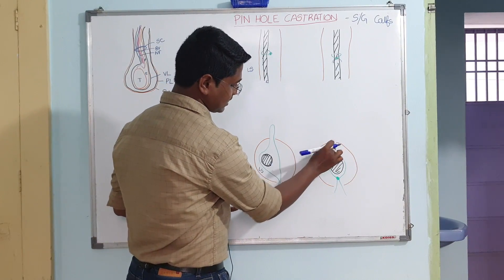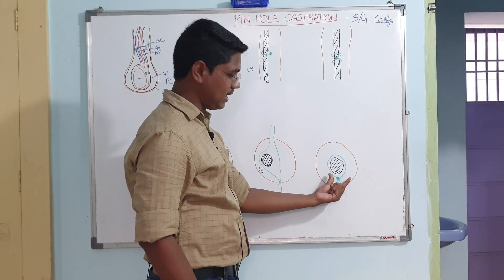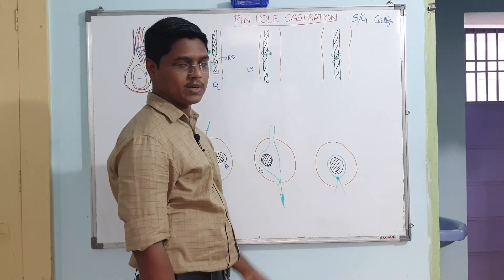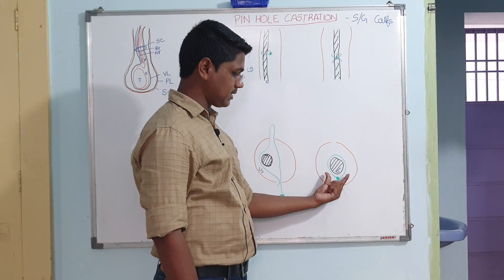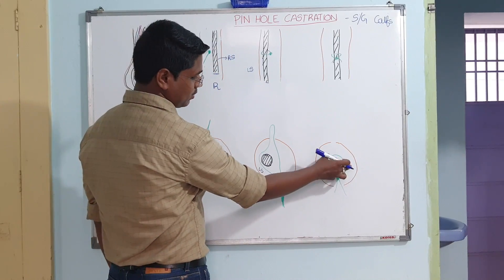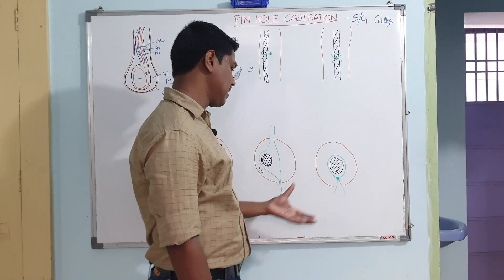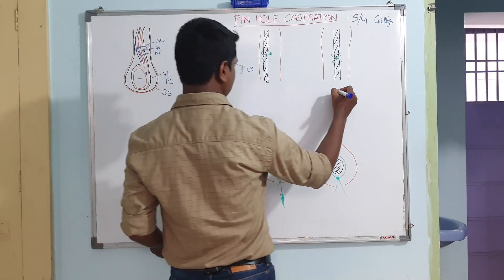Bring back to the inserting side and then simply ligate it. When you tighten, since it is the same hole, it will come around the spermatic cord and you can ligate the spermatic cord. Tighten it and simply cut the suture. The suture will be inside the scrotal sac — it won't be outside the scrotal sac.